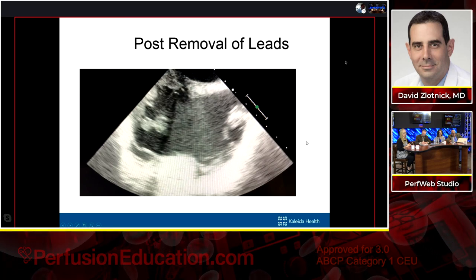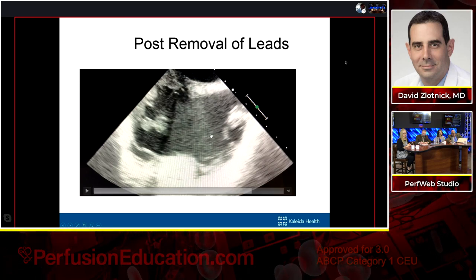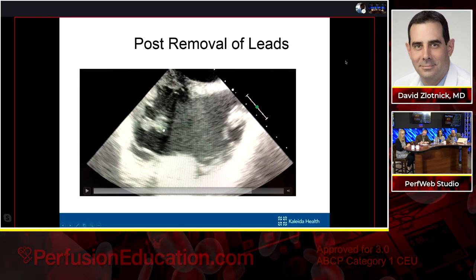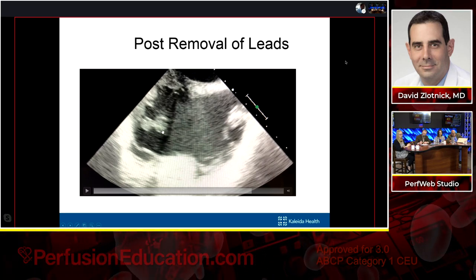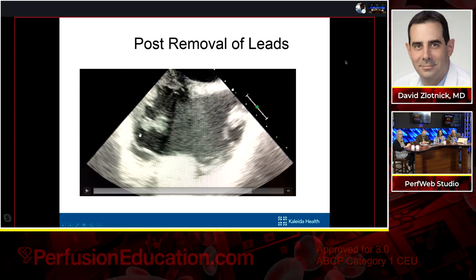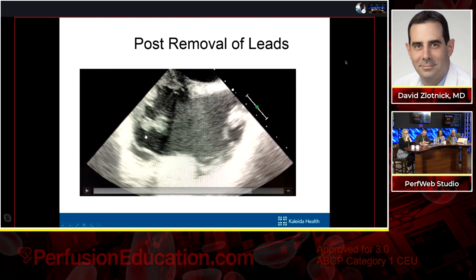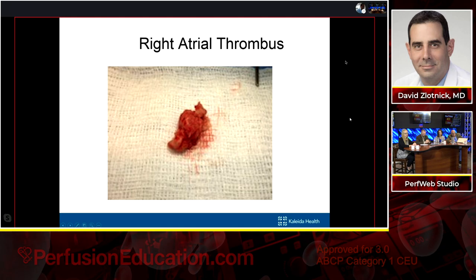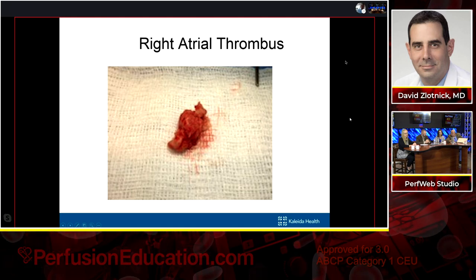And so we went back in with the AngioVac. I was able to get it up against the tip of the AngioVac, and then I used a snare, put the snare over it, cinched down, took it off the wall, and then externalized it out. And that's what it looked like after we got that out. Wow. There it is again. Now, wow.